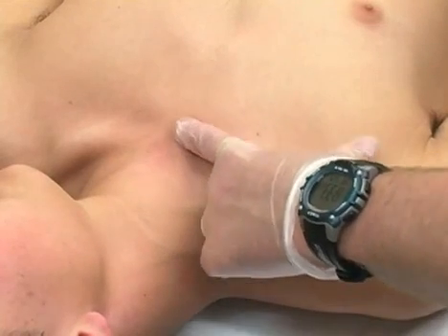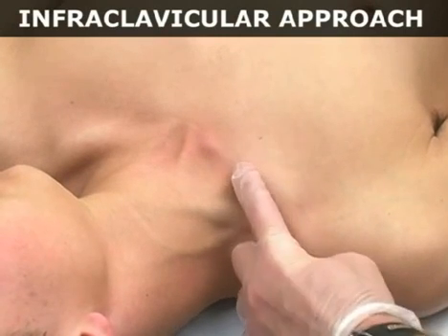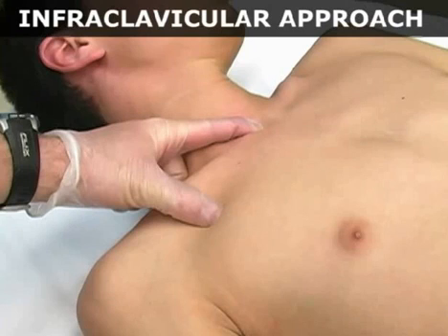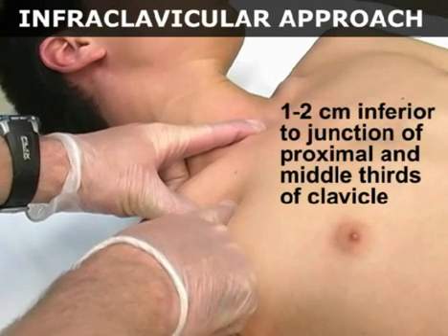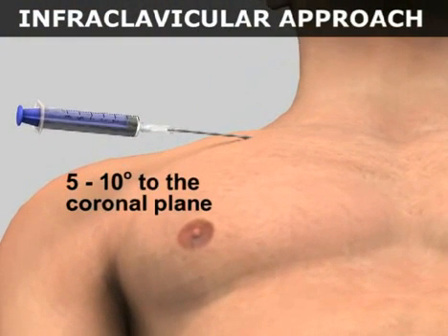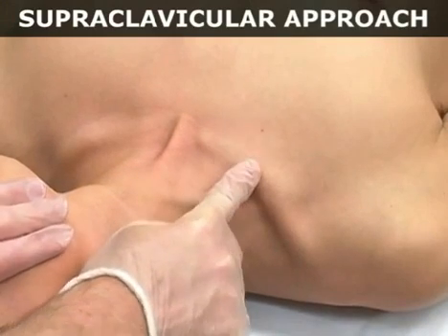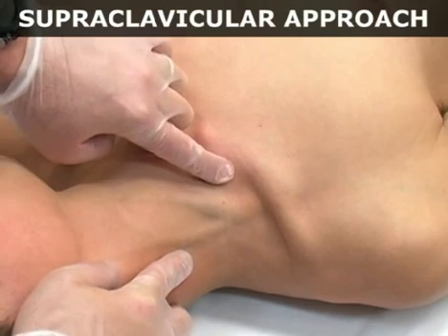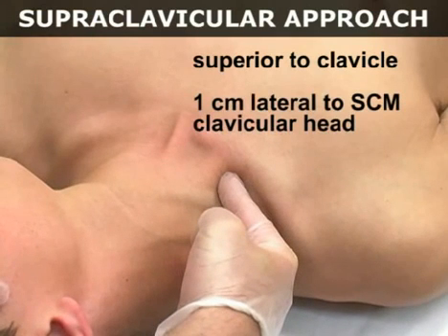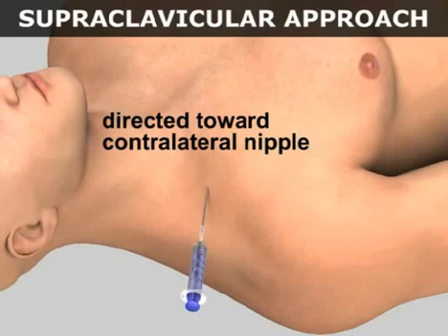There are two approaches to subclavian vein cannulation. For the infraclavicular approach, which is the most commonly used, first establish the location of the clavicle. Place the index finger of your non-dominant hand in the sternal notch and your thumb on the midclavicle. Needle entry occurs 1-2 cm inferior to the junction of the proximal and middle thirds of the clavicle. The needle is held 5-10 degrees to the coronal plane of the body and is directed towards the sternal notch. For the supraclavicular approach, establish the location of the clavicle and of the sternal and clavicular insertion points of the sternocleidomastoid muscle. Needle entry occurs 1 cm lateral to the clavicular head of the muscle. The needle is aimed 10 degrees anterior to the coronal plane of the body and is directed toward the contralateral nipple.